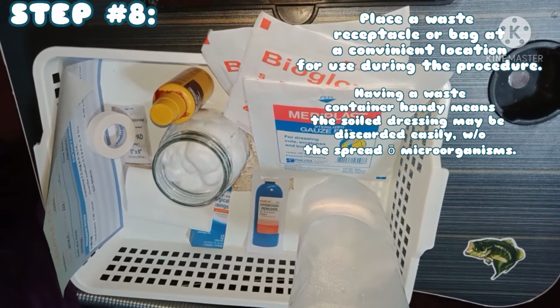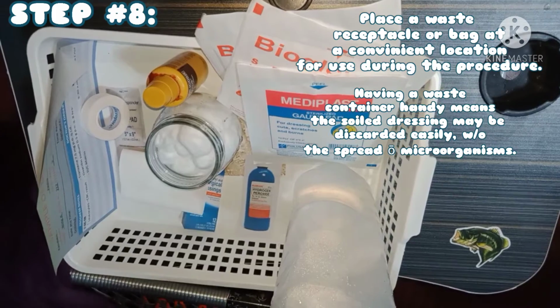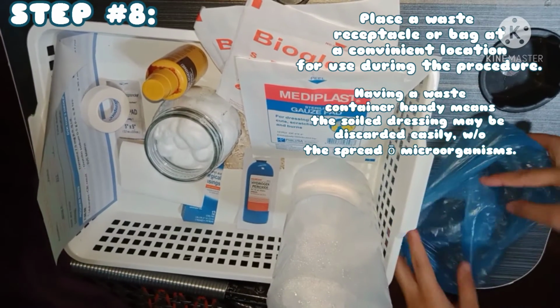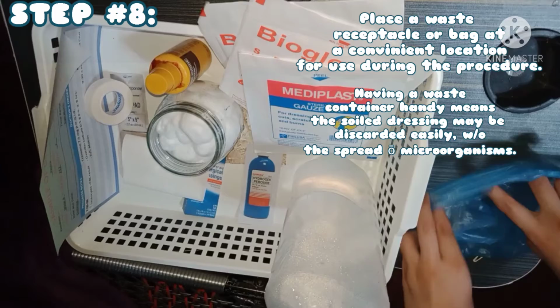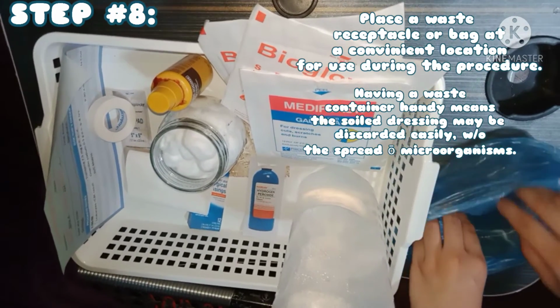Step number 8. Place a waste receptacle or bag at a convenient location for use during the procedure. Having a waste container handy means the soiled dressing may be discarded easily without the spread of microorganisms.